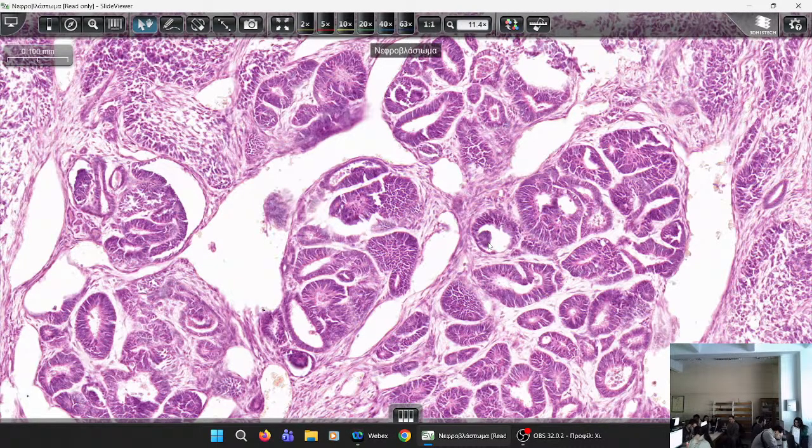Think of embryology in the development of the kidney. What are these structures? Primitive, they are primitive structures of what in the adult, in the kidney of the newborn and the adult? Which structures form this way? You have an empty space lined by cells, epithelial cells, and you have a projection that gradually becomes a tuft. So, what do they look like? They look like primitive what? No, that's too primitive. That's in the tumors in yolk sac.